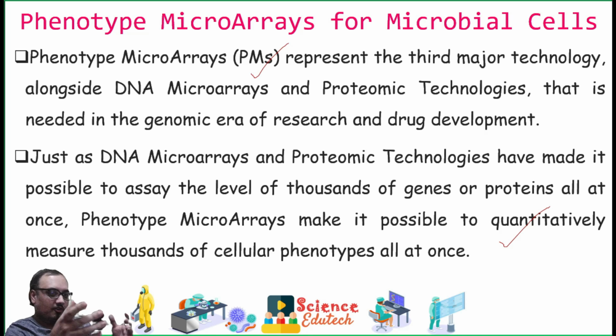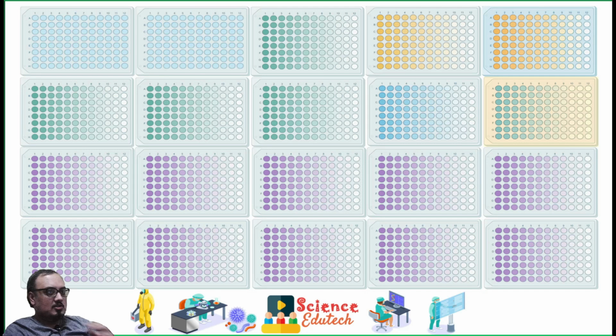These phenotypic microarrays also help us to correlate genotypes with phenotypes, determine cells' metabolic and chemical sensitivity properties, discover new targets for antimicrobial compounds, optimize cell lines and culture conditions in bioprocess development, and characterize cell phenotypes for taxonomic or epidemiological studies. So this is how the phenotypic microarray looks.